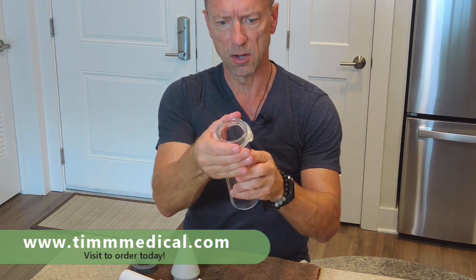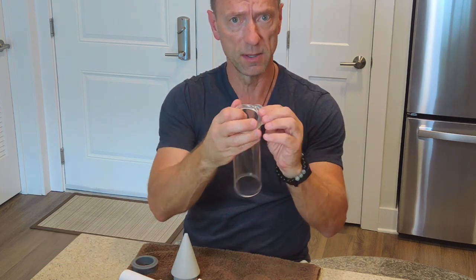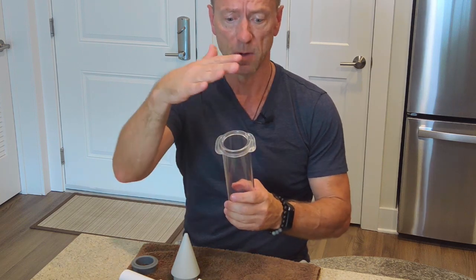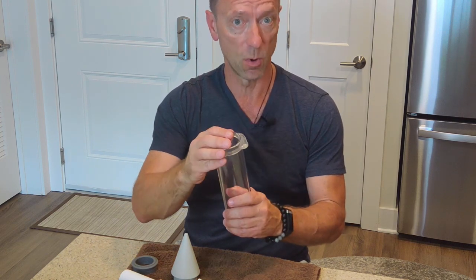You might want to roll it down a little bit and then apply some lubricant here on the end of the cylinder, so that when you're ready to slide this off and transfer it from the cylinder to the base of the penis, you're able to do that successfully and smoothly without it trying to roll off as you do that. So that's the first way. That's the manual way to do this.